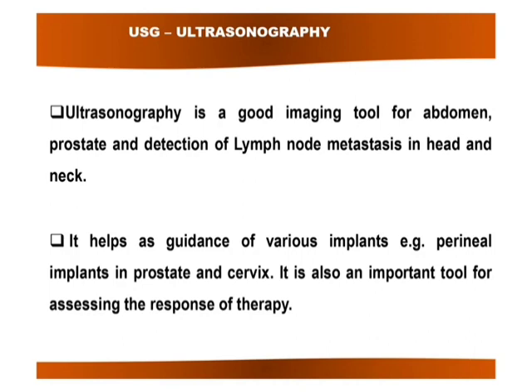This system acquires the 3D image in order to help align the target to correct the intrafractional error, and it is mostly used in prostate and lung tumors. In the conventional method of simulation, 24 to 47% of cases show inadequate tumor coverage, and it was observed that 55% need CT information, and this will help to increase the overall survival by 6 to 10%.